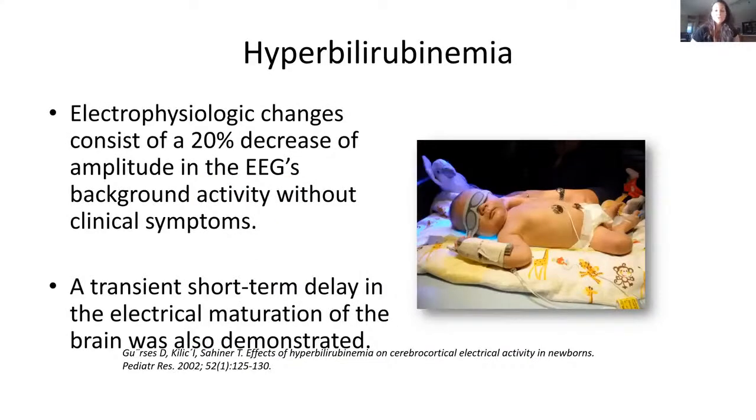Another metabolic situation that is getting more and more attention is hyperbilirubinemia. And of course, we are definitely wanting to manage hyperbilirubinemia, especially high levels. Those of us working at Stanford right now, we've put it into our top 10 list: babies who come in at the 95th percentile or higher. We are doing aEEG on those babies as a screening, just to be looking at what's going on.